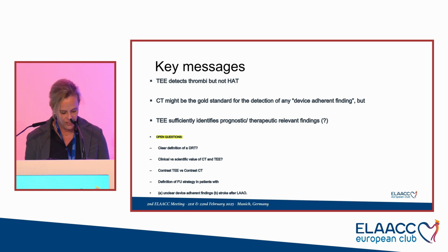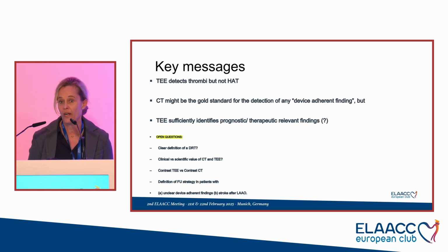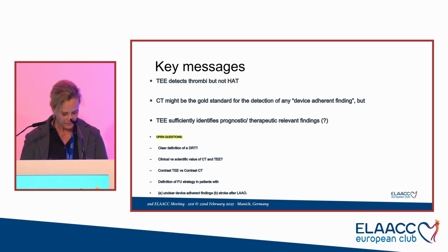So we also have to see if it can be a good value to look at these patients with contrast TE, for example. And we have to define, so what is a follow-up strategy for these patients? So what should we do? How frequently should we do follow-ups in patients who have an unclear device adherent finding? Or, for example, in patients who had a stroke after left atrial appendage occlusion? So to summarize, no clear definition in my eyes and a lot of open questions to discuss.